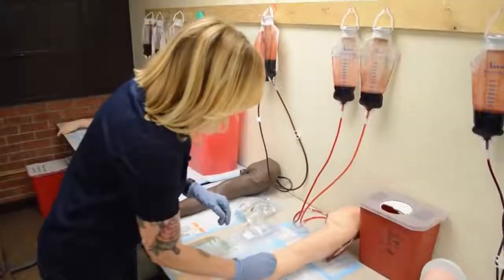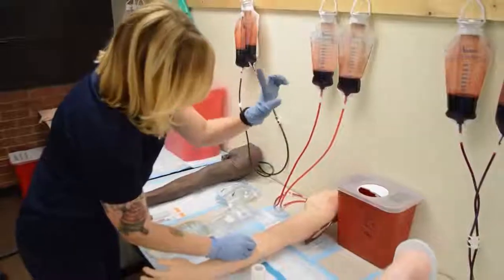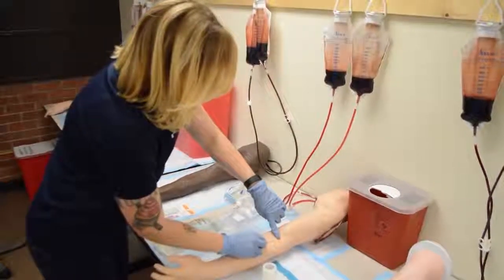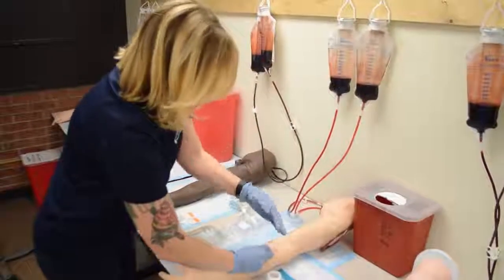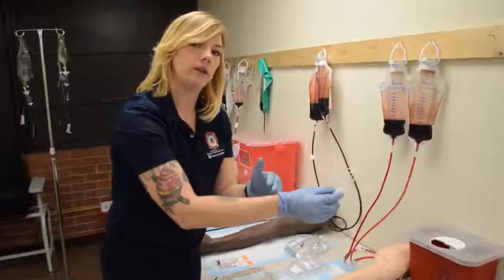But if I'm having trouble, if I have my IV catheter here and I've lost my vein, I can use this opposite hand to go again and start feeling. And at that time I can redirect my needle using my arm as my needle. It's not just your hand. You are an extension of that needle.